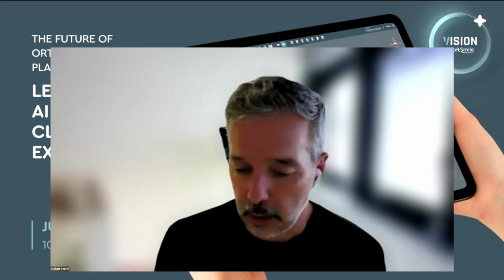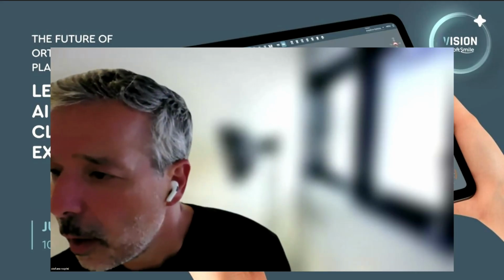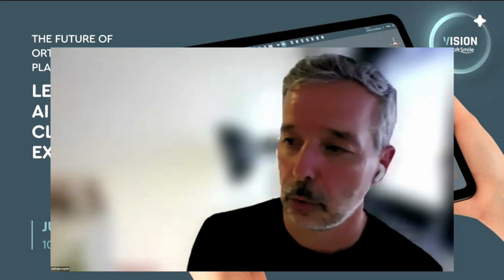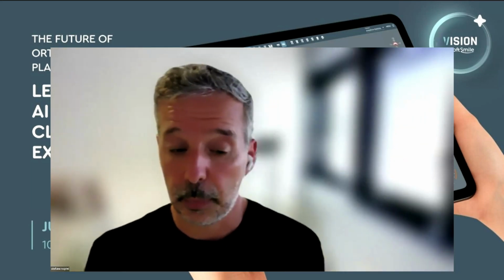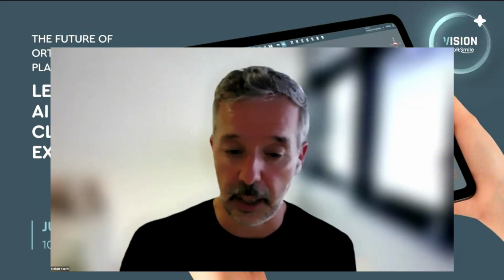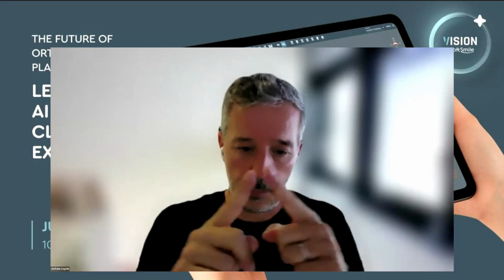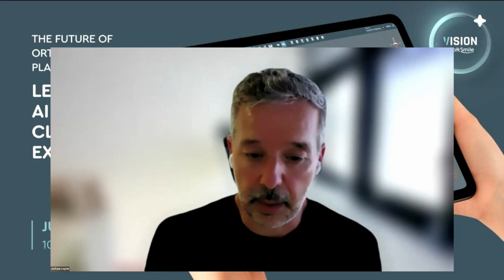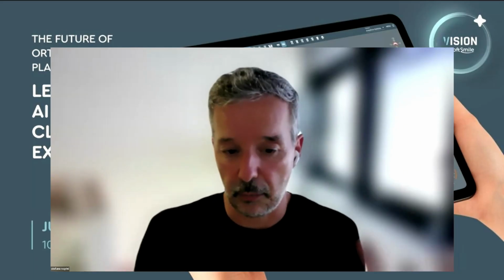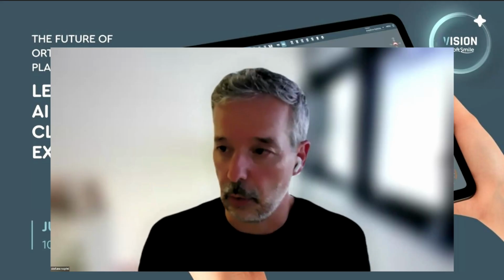Okay. If you don't have any other question, thank you for joining. Oh, yes, of course. I always recommend not preparing all of the cases at once, but subdividing the case into steps, every time 10 steps, and another 10, and another 10. Obviously it depends on the distance between you and the doctor, or maybe when the doctor works alone.